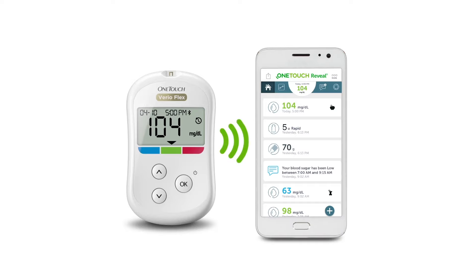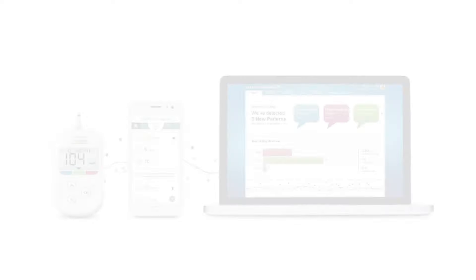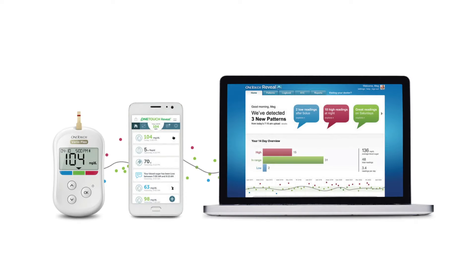The OneTouch VarioFlex meter syncs with the OneTouch Reveal mobile app. The OneTouch Reveal mobile app allows you to see patterns in your blood sugar results, set reminders for medications or to check your blood sugar, and you can also share your results with your healthcare professional.